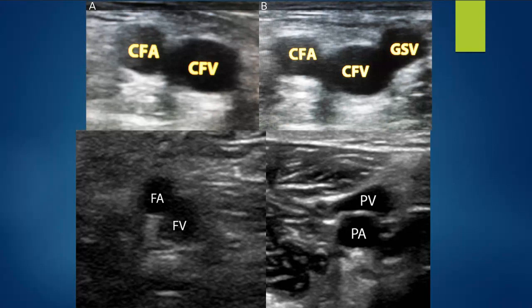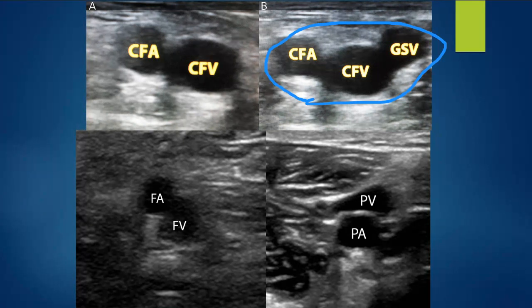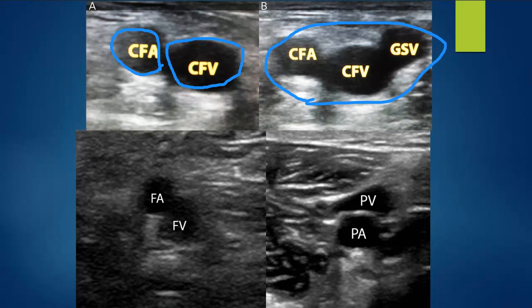We want to evaluate on Doppler a few seconds of normal venous flow before we squeeze — establish that normal waveform and then give the augmentation. We also want to show a second or two of venous flow returning back to normal after the squeeze. That's how the radiologist sees on the waveform that the valve is functioning properly. We want to see: normal waveform, then we squeezed, then the vein closed, and now it's working back to normal — with the squeeze somewhere in the middle of that spectral waveform window.